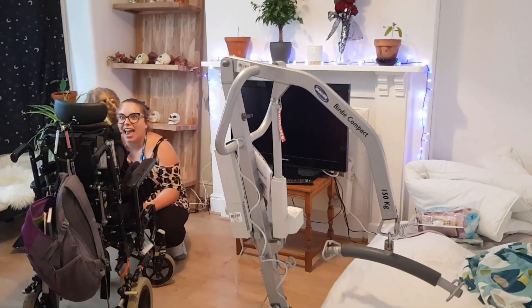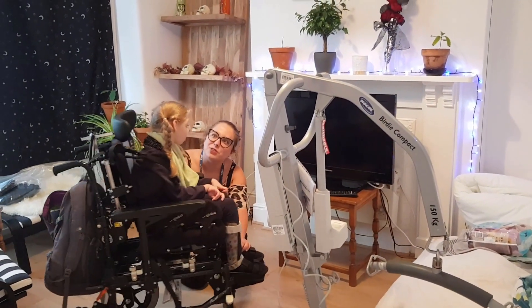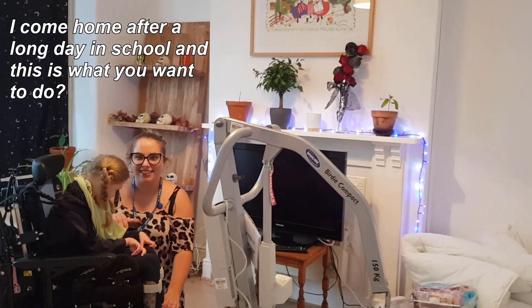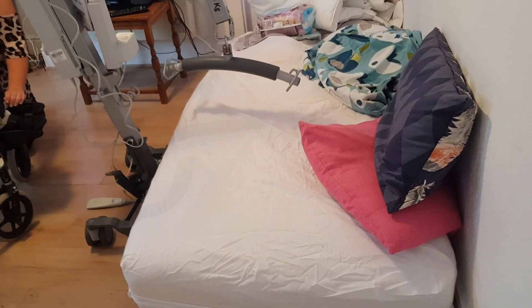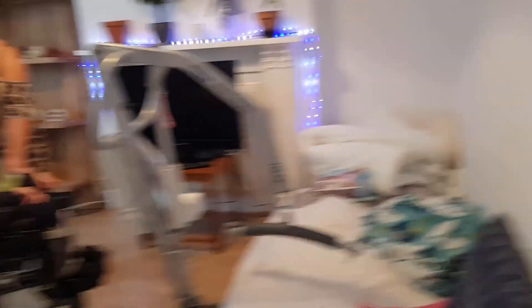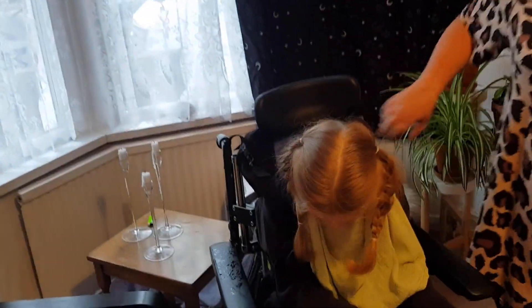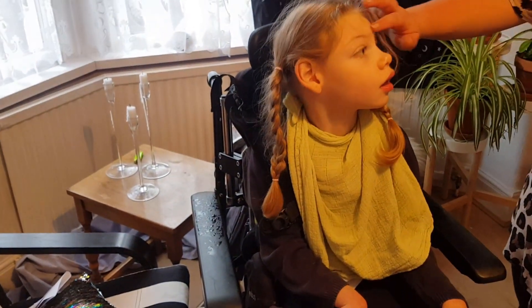There it is. There's Dani and there's Eileen. I don't know how to use a hoist but Dani does. The first thing Dani said was you need to get a proper bed so you can actually get it under the bed, rather than just shoving it under the mattress. She's also said we probably can't get Eileen onto the floor from the hoist unless there's two of us, but at least we'll be able to hoist her bed to wheelchair, which is kind of what I'm after.